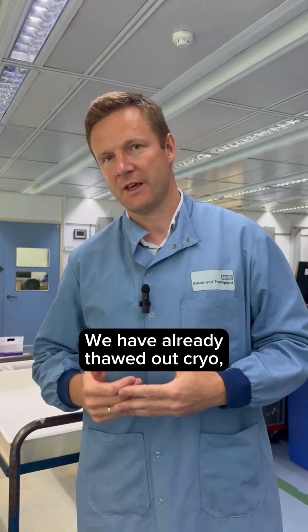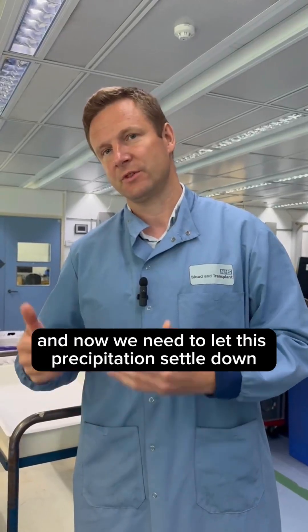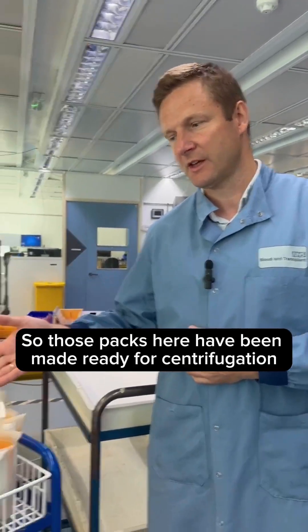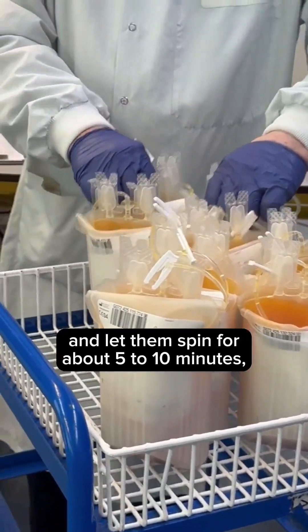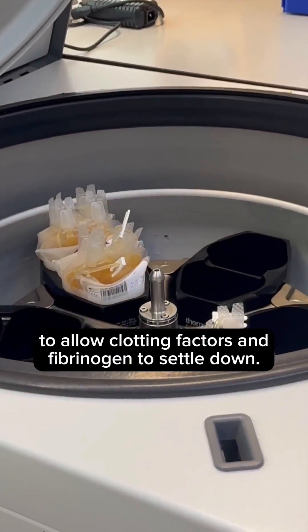We have already thawed out the cryo so precipitation has taken place, and now we need to let this precipitation settle down at the bottom of the packs. To do that we need to spin the packs. Those packs have been made ready for centrifugation and we're going to put them on the centrifuge and let them spin for about five to ten minutes to allow the clotting factors to separate.